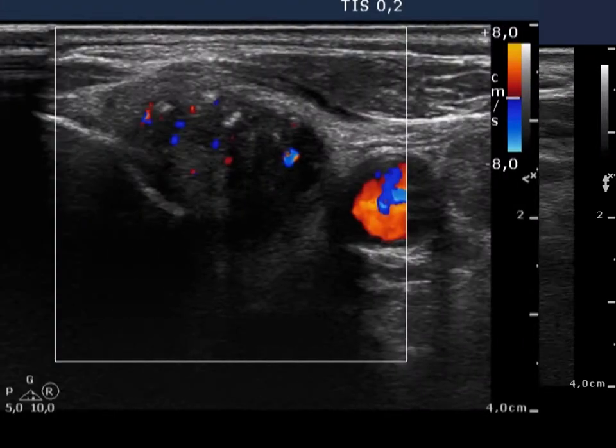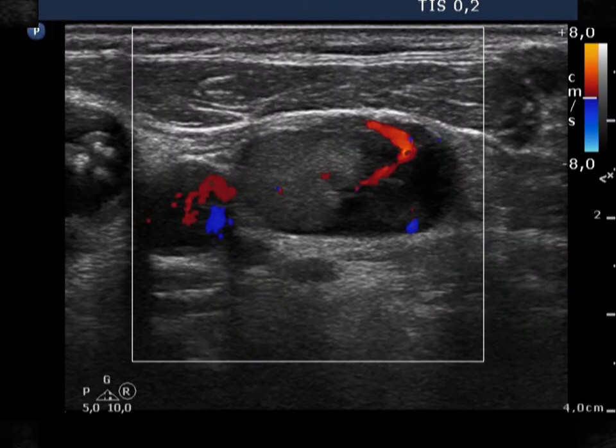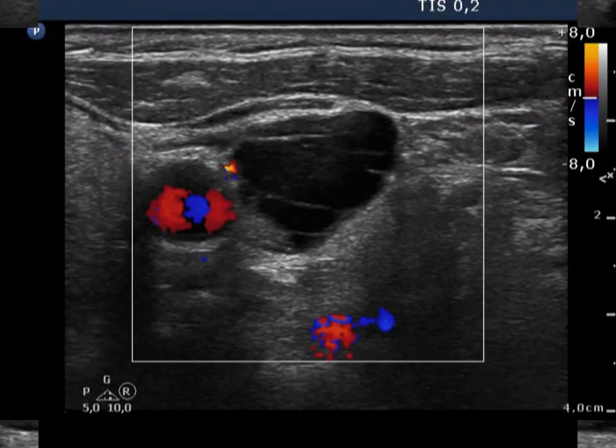The thyroid nodule and one lymph node present a type 3 vascular pattern, while another node shows a type 1 pattern.